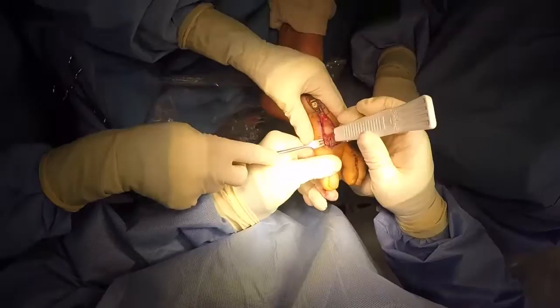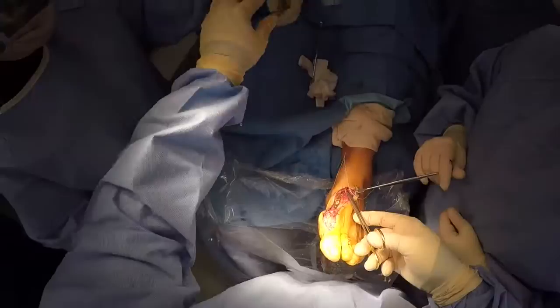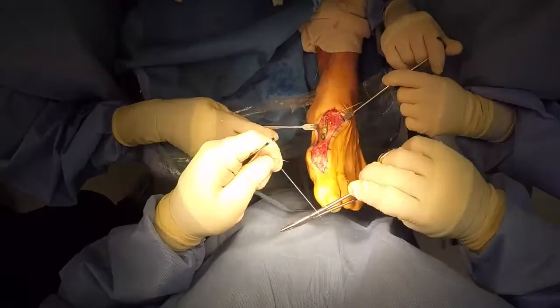The staple is tamped into place, and we irrigate our surgical site, and here we are performing layered closure. We begin with our deep layer. So the capsular and periosteal tissues are opposed, utilizing 3-0 Vicryl. And in this case, we're using a running suture technique, ensuring that we cover all of our buried hardware deep.